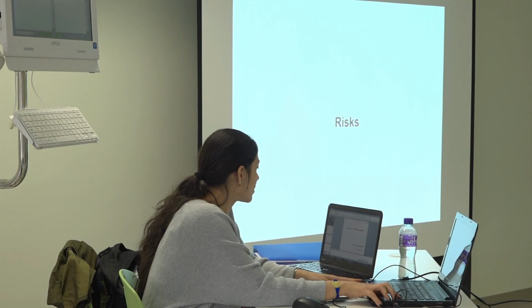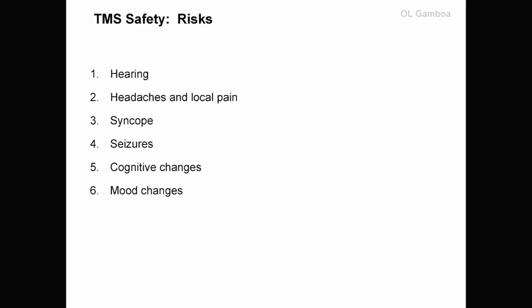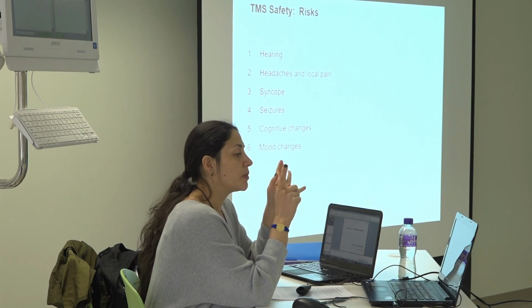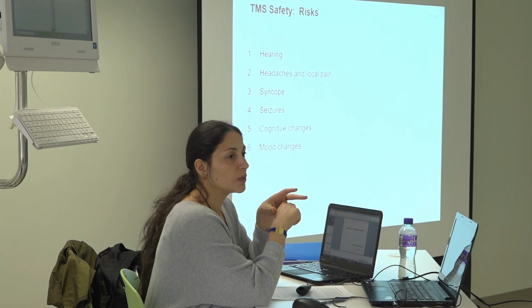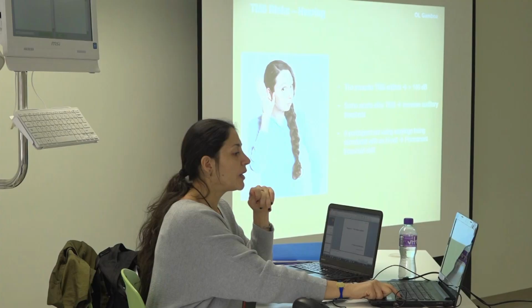Now we talk about the risks. I'm going quite fast actually, but okay, it's good. This is really the part that you want to know, because you want to emphasize this when you are talking to your participants. So there are several risks: hearing, headaches and local pain, migraines also included in the headaches, syncope, seizures, cognitive changes, and I put actually psychological changes.